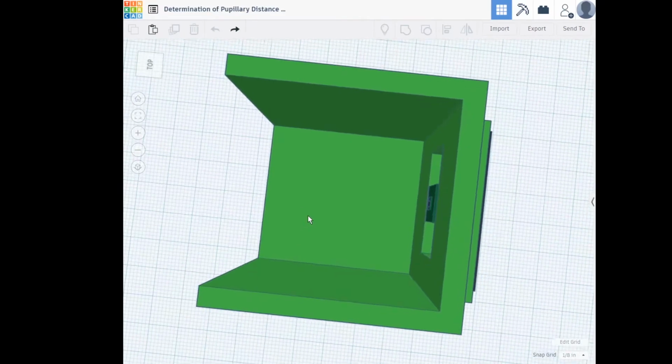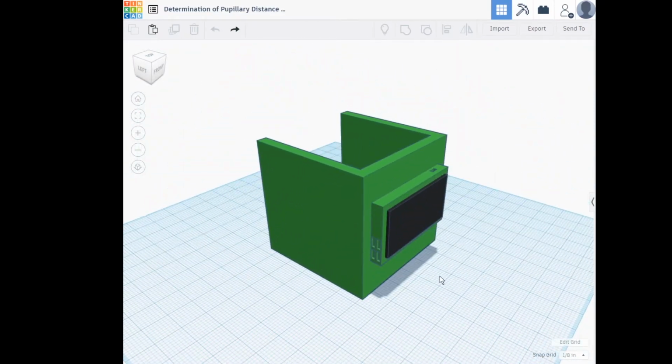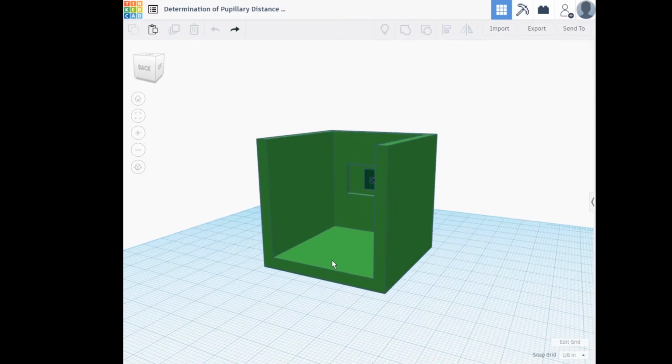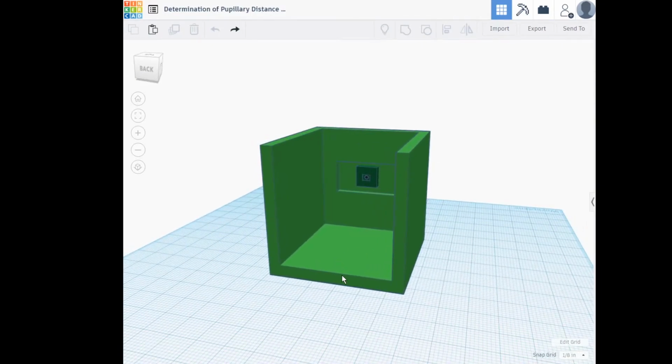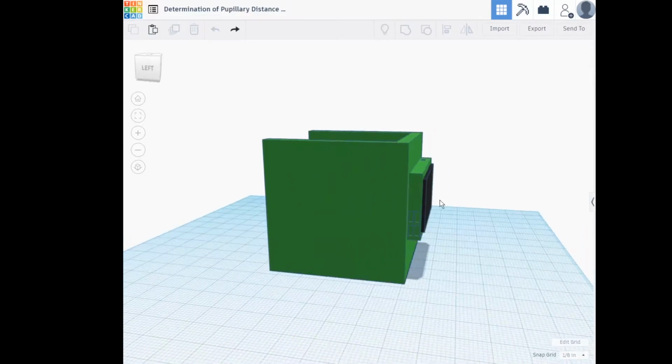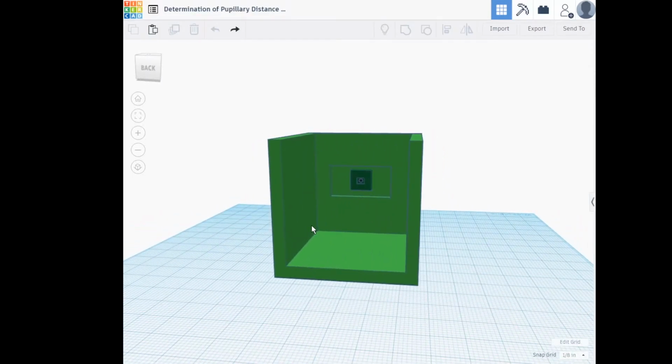So in the whole process, the researcher is standing in the front side of the prototype, allowing him to capture the images or browse through the images while also monitoring what is happening in the screen. And on the other side, the back side, the subject would simply place their face near the bottom of the prototype and have their eyes scanned. So it's a very straightforward and simple process of capturing the subject's eyes. However, it is also worth noting that the whole device must not be moved in order to ensure that the images being captured with the prototype are steady and accurate.